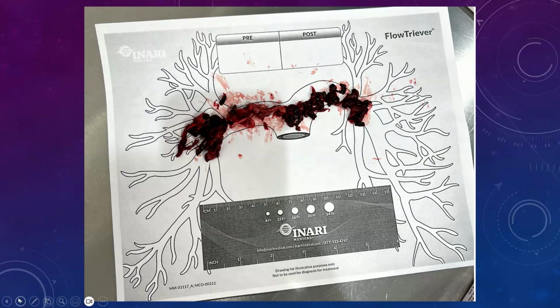She actually is now extubated and completely neurologically intact. So this should impress upon you that when you don't know what's going on, you can really learn a lot when you drop that echo probe in, and it drastically alters your management, right? Without that echo probe, we can't make the diagnosis of PE with enough certainty to get the IR folks in there and aspirate all that clot out.